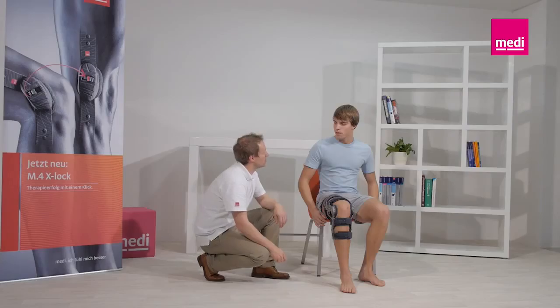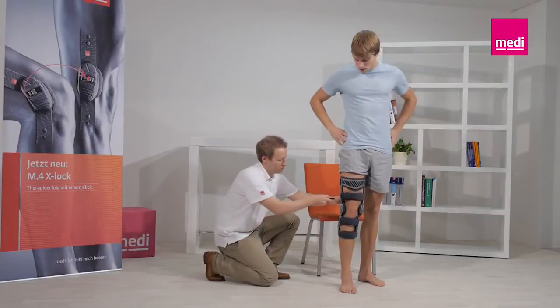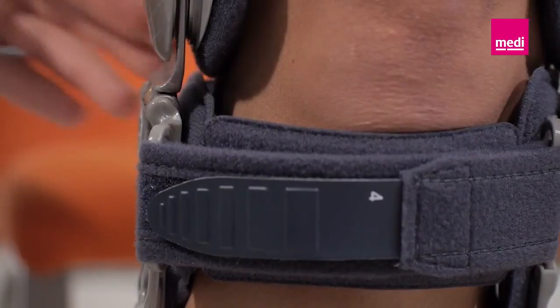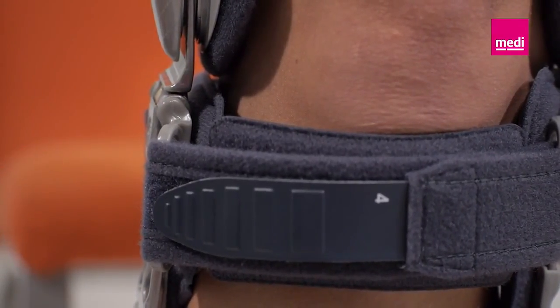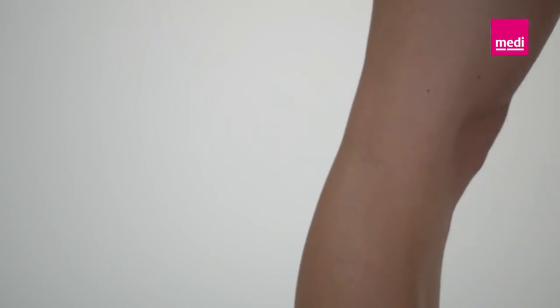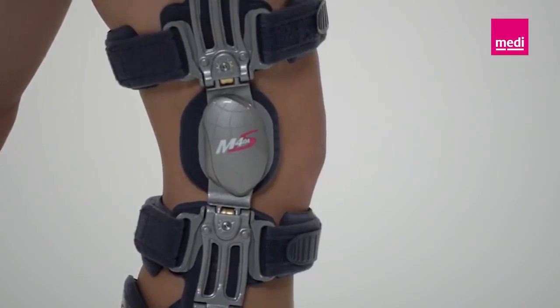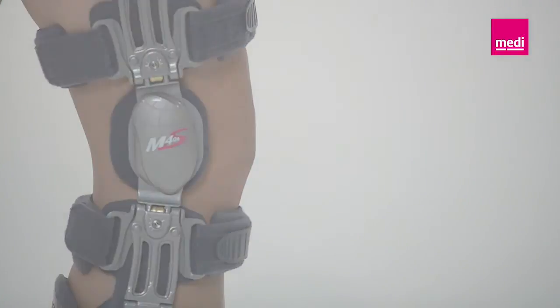With the patient now standing, set the force by turning both adjusting screws one quarter of a turn. This setting is a good starting point when wearing the brace for the first time. Make sure the orthosis has been applied properly. For conservative treatment, the orthosis should not be worn for more than two hours a day. The orthosis can then be worn for longer periods depending on how well the patient tolerates it. The orthosis should, above all, be worn for activities that normally cause pain.